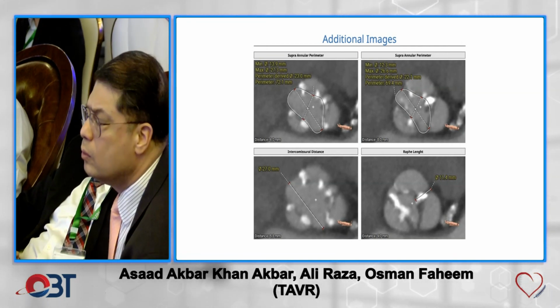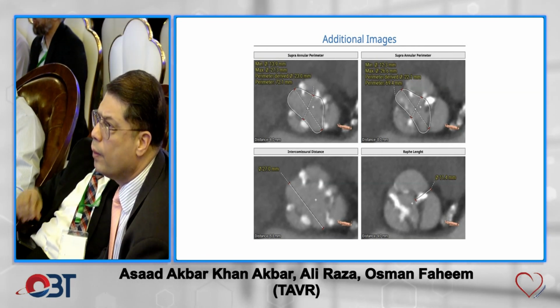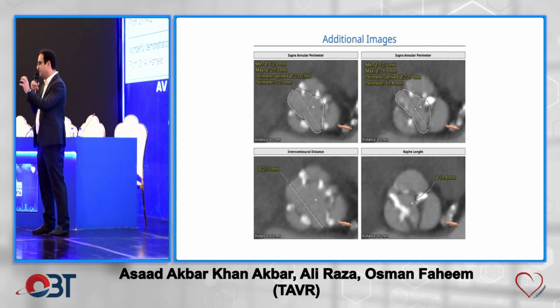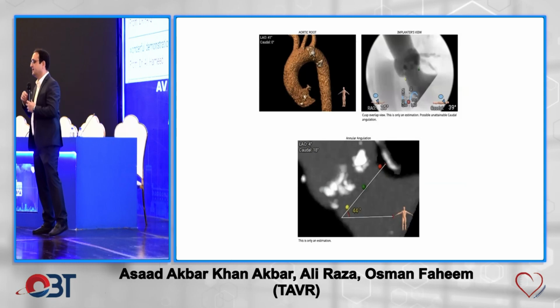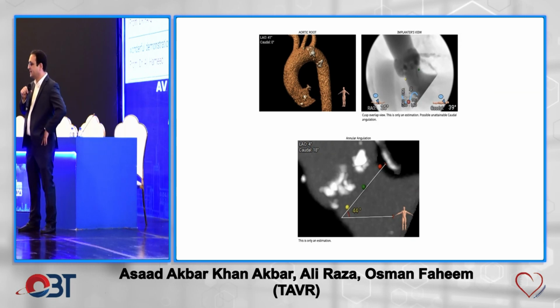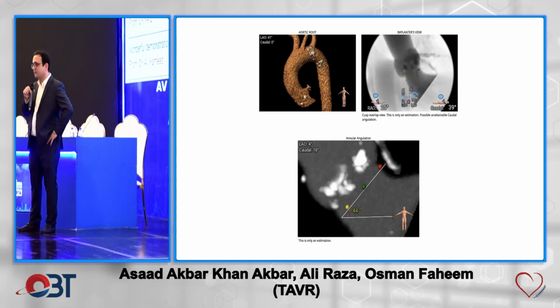Also, 34 के जो strength है, radial force वो सबसे ज़्यादा है, so it's going to push out in a very abnormal way in a fish mouth sort of a valve. और overall ये जो भी recently जितना data आ रहा है 34 valves का, उसके अंदर mortality भी ज़्यादा आ रही है, pacemaker rates वैसे भी in general थोड़े से ज़्यादा आ रहे हैं, तो maybe that's why probably you go with a 29. और lastly, 34 does not have an external skirt जो कि 29s में है, so you have a better chance of sealing it.